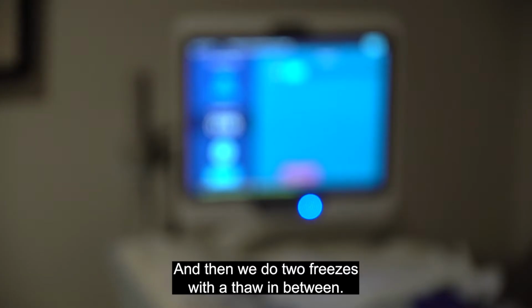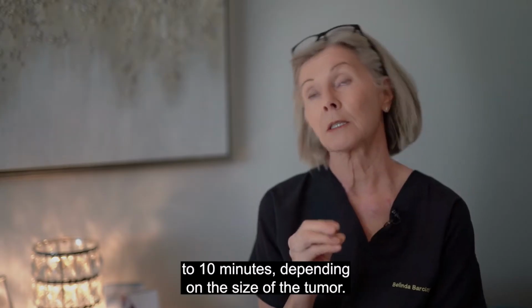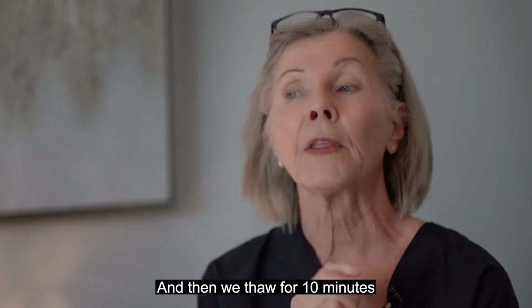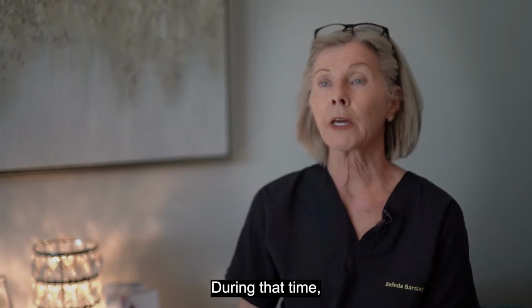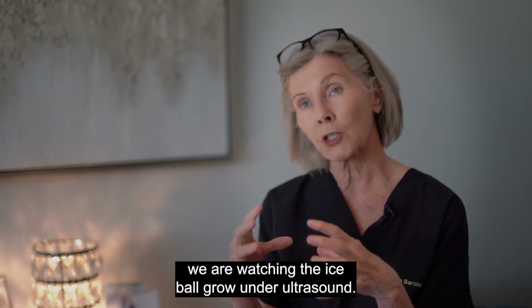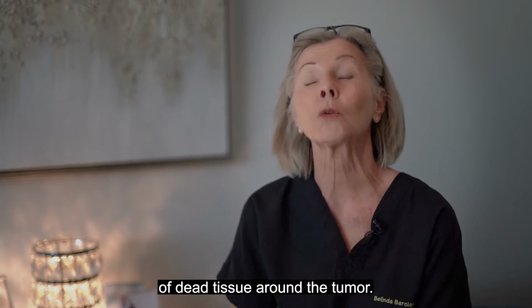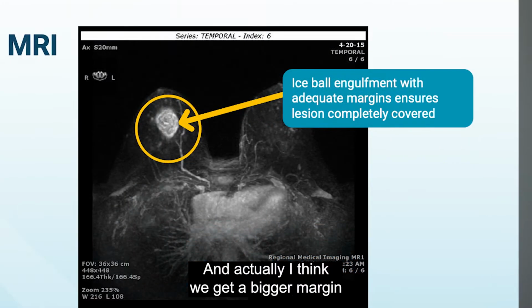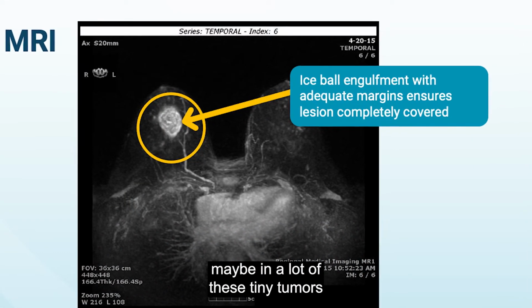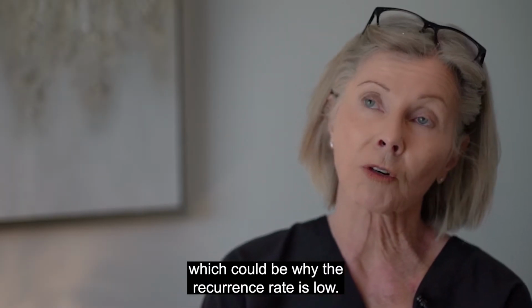And then we do 2 freezes with a thaw in between. So we freeze anywhere between 6 minutes to 10 minutes, depending on the size of the tumor, and then we thaw for 10 minutes, and then we freeze again for the same amount of time. During that time, we're watching the ice ball grow under ultrasound, so we actually see it engulf the tumor. And the idea is to create at least 1 centimeter of dead tissue around the tumor. So we get a margin that way, which is what we aim to get in surgery. And actually, I think we get a bigger margin in a lot of these tiny tumors than the surgeons even do, which could be why the recurrence rate is low.